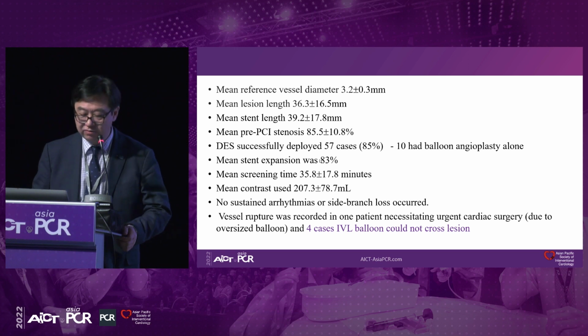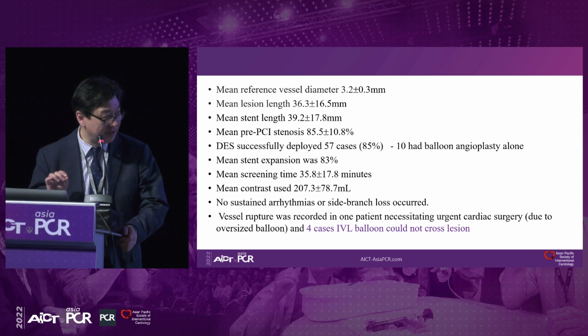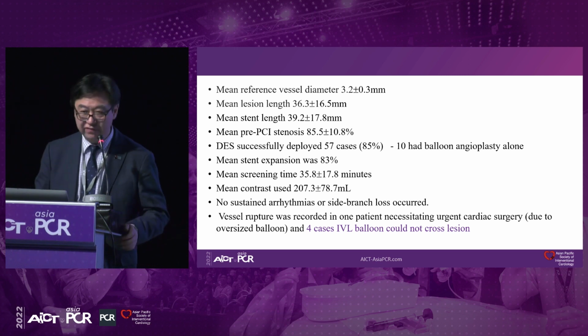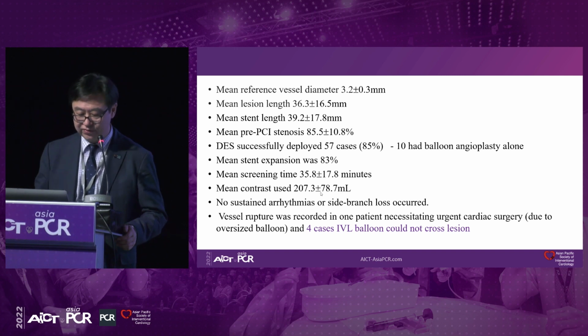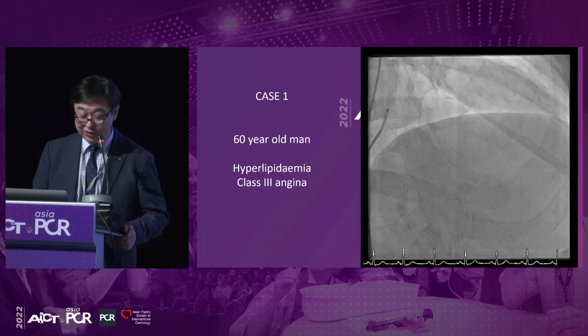So we will wait to hear Illumin 4, where one of the subgroup sub-endpoints, secondary endpoints, was 90% stent expansion. Maybe you try too hard, you get complications. There's a talk of some issue if you get too crazy with the dilatation. But median fluoroscopy time is 35 minutes. Mean contrast is 200 mils. They're complicated lesions. One patient had a problem with significant oversizing of balloon and needed surgery due to a rupture.